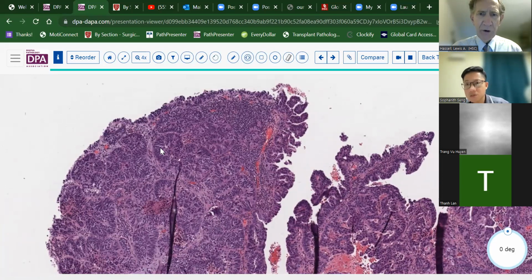And of course, we would do the p53 stain. Now, it was pointed out to me recently that because of the challenges in interpreting p53 stains, accompanying a p53 stain with a p16 stain is oftentimes a very helpful tool, particularly in the cases where you may have the so-called null type expression of p53.